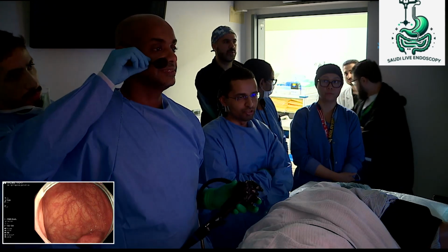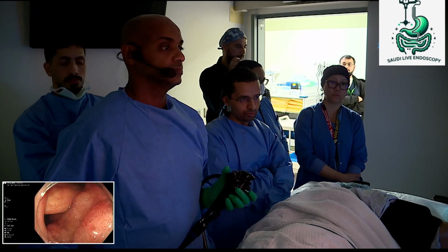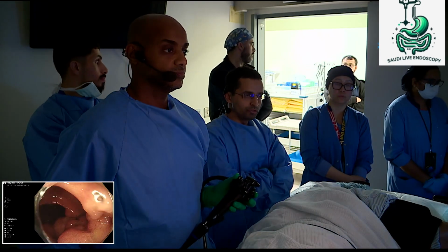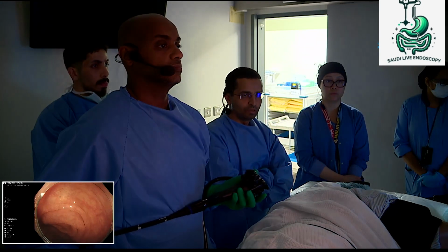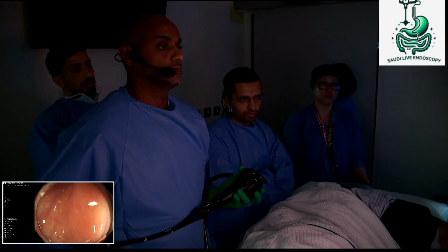Sure. So my name is Majid Alsahafi. We are here with Dr. Ammar. We have this 47-year-old woman who has a history of diabetes and hypertension. She underwent a screening colonoscopy, and she was found to have a large bulky lesion in the right colon. At that time, biopsy was taken and showed low-grade tubular adenoma.